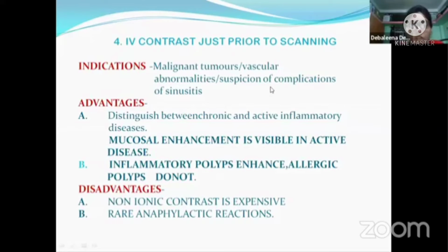Now, what are the advantages of contrast? It distinguishes between chronic and active inflammatory disease. Mucosal enhancement is visible in active disease, not in the chronic one. The inflammatory polyps enhance and allergic polyps do not.